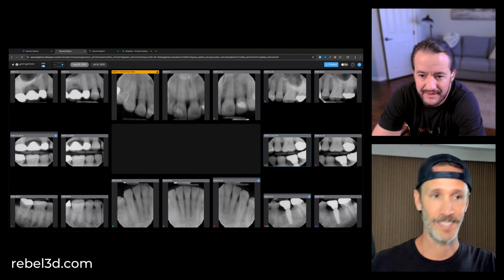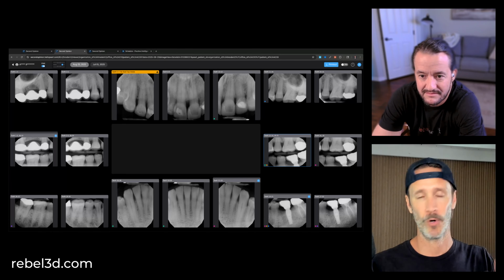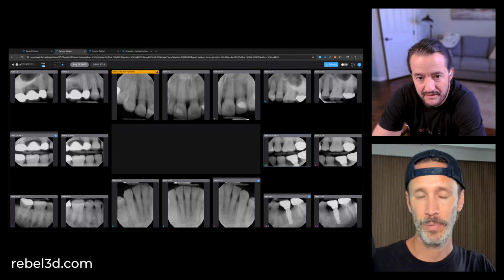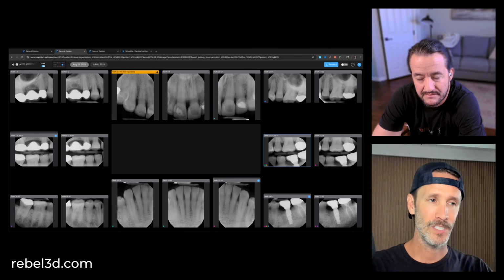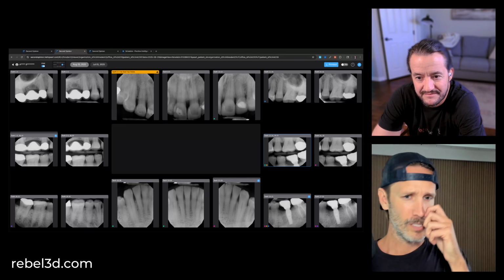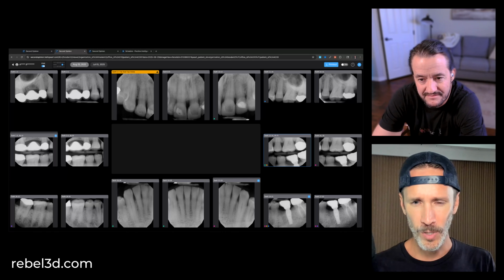Whoa. Which is massive. That's doing no more dentistry, or not seeing more new patients, let's say. Just increasing your case acceptance can go up like crazy. And the second thing they usually say is they always have a story. They always have something like, there was this one thing and I had missed it the previous year. Pearl showed it. I checked it out.